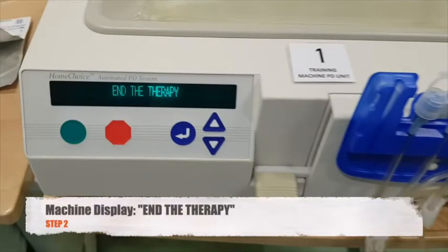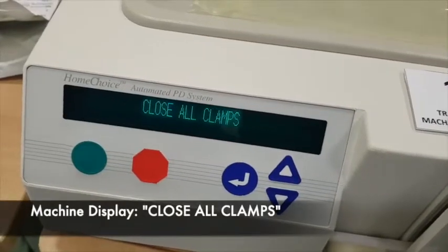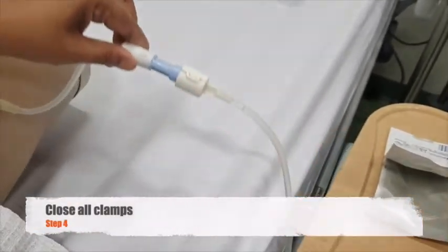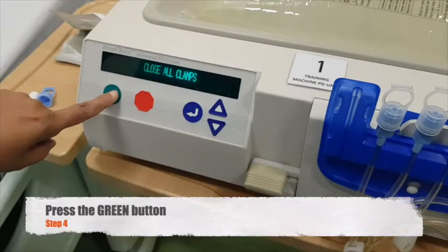The machine will usually display end of therapy when the PD session has already finished. Seeing this, press the green button. The machine will then display Close All Clamps. After seeing this message, you can now close all the clamps from the patient's transfer set to the patient line, as well as the other lines including the drain bag. Once again, press the green button.